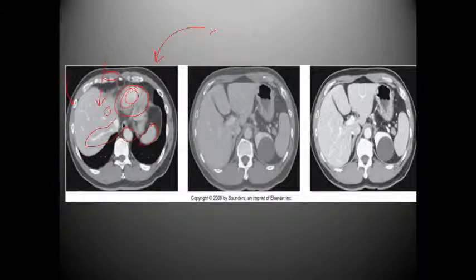However, if we were to modify that so that we can better visualize some structures, we see that this is almost a bone window here. Notice that the contrast and the liver have each been toned down, and now they have a gray appearance. And you have a cyst here, and the bones don't necessarily stand out as white. So we would say that this would have low contrast, simply because there are multiple shades of gray in this and fewer whites.